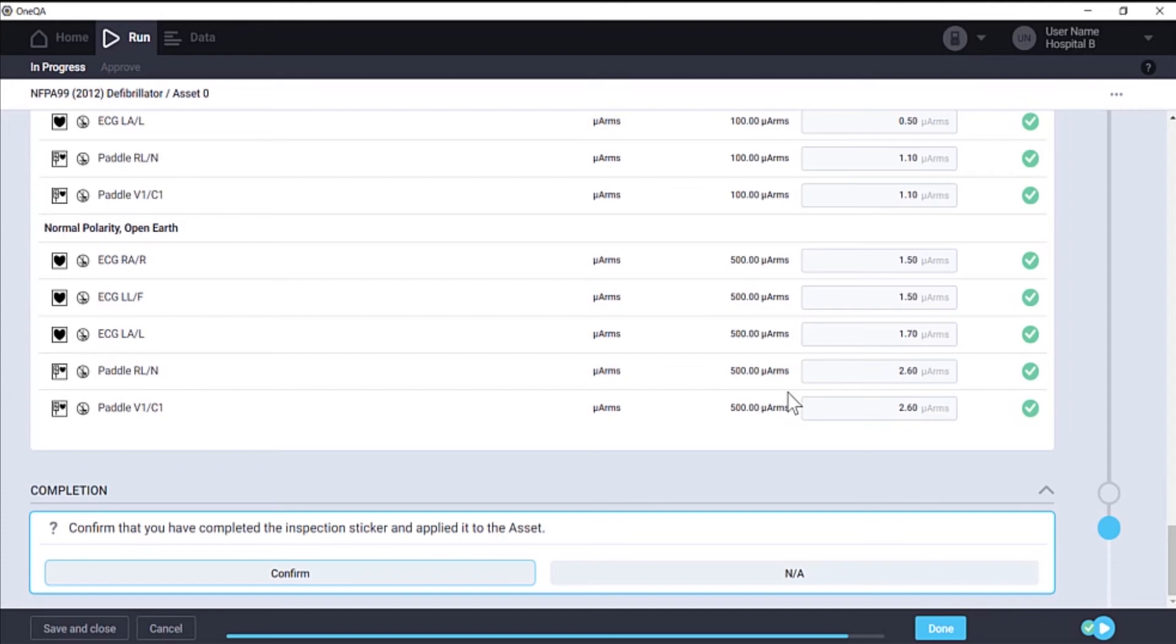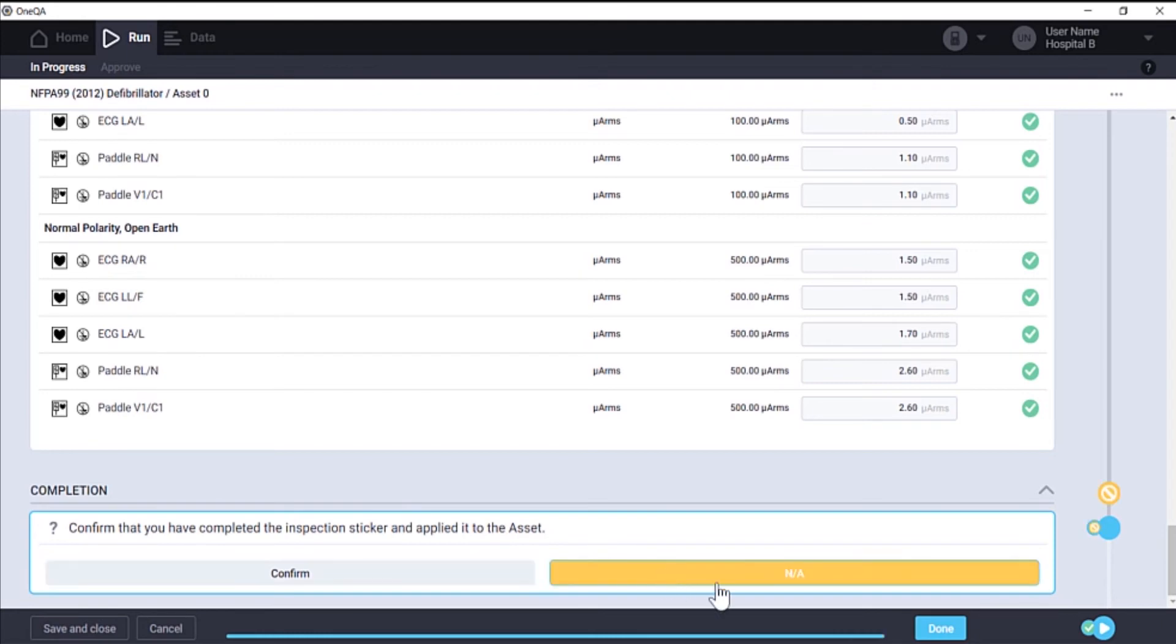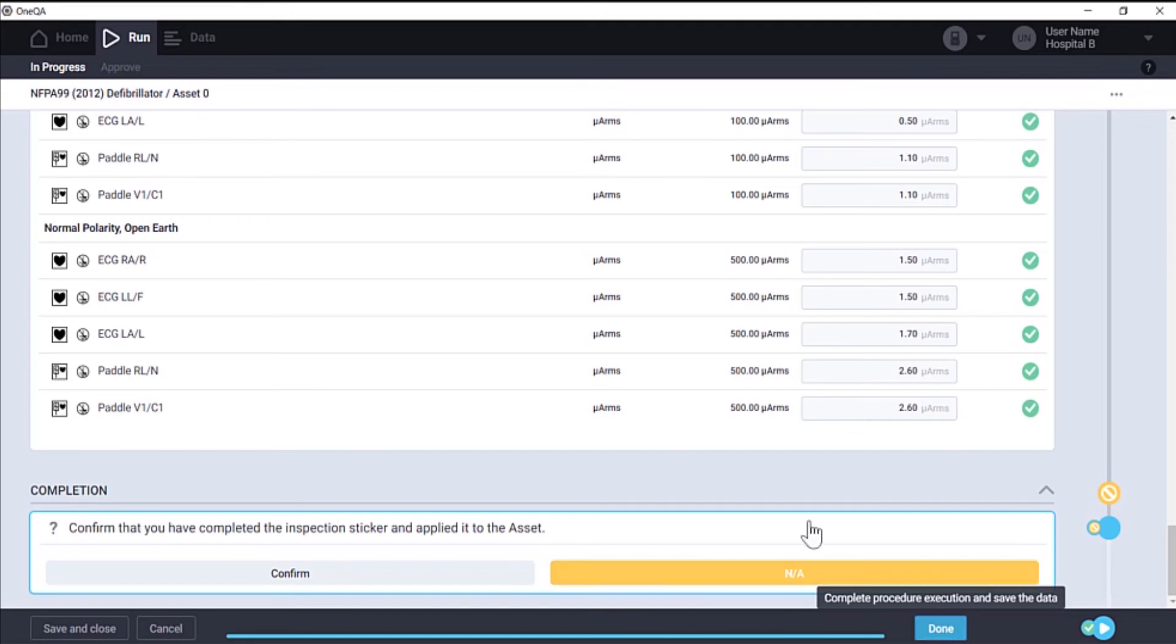Finally, we want to confirm that we've completed the inspection, but in our case, we're not going to apply a sticker to the asset. Once the procedure is complete, we can click done and save the data.